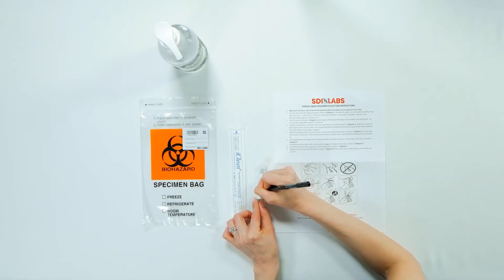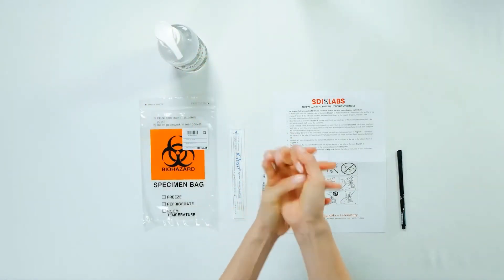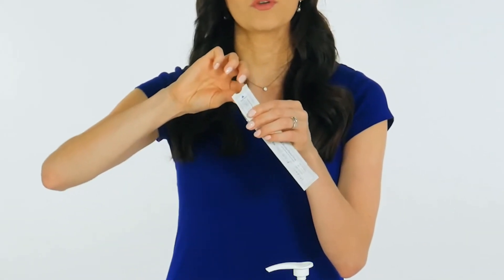Label your tube with your first and last name and date of birth. Before you give your sample, be sure to sanitize or thoroughly wash your hands. Partially peel open the swab package and remove the swab.